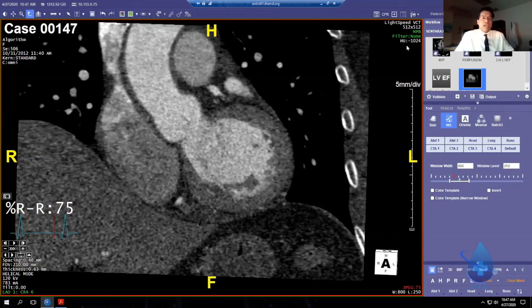Well, Sir Hounsfield came up with a Hounsfield unit scale the year I was born, in 1972. He got the Nobel Prize for CT. And the scale he came up with is called the Hounsfield scale. On this scale, water is set arbitrarily to 0, and air is set to minus 1,000.